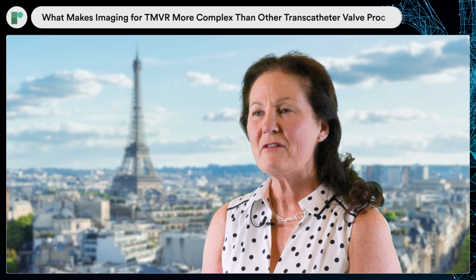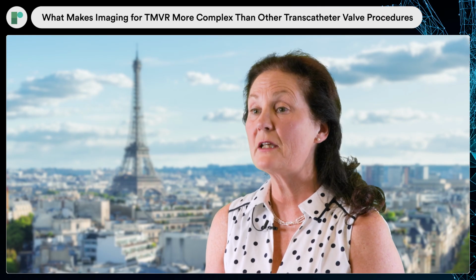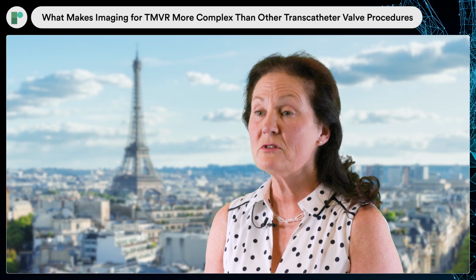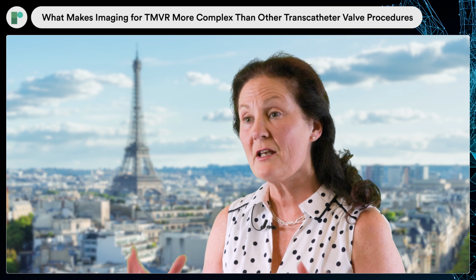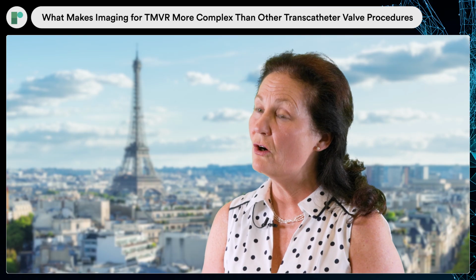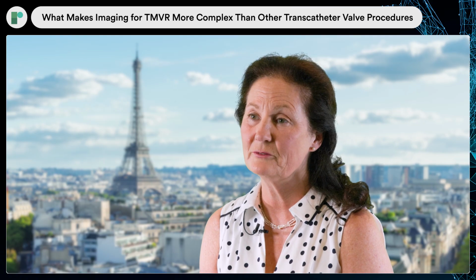TMVR imaging is very complicated because the mitral valve is not the aortic valve. The aortic valve is simply at the end of a tube, whereas the mitral valve is a very complicated dynamic structure. It's saddle-shaped. It's associated with the aortomitral curtain. It can be related to the left ventricular size, the left ventricular outflow tract, and the fact that there can be calcification around the mitral valve annulus or not. So it's not at all a tubular structure with straightforward imaging. It's much more complicated than that.